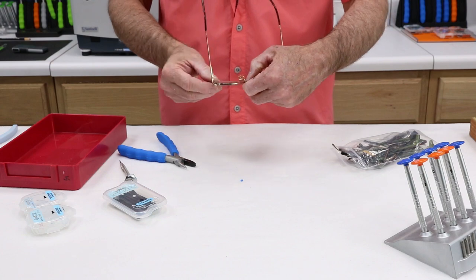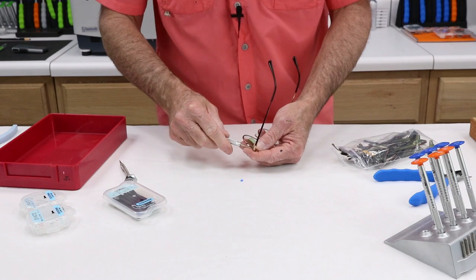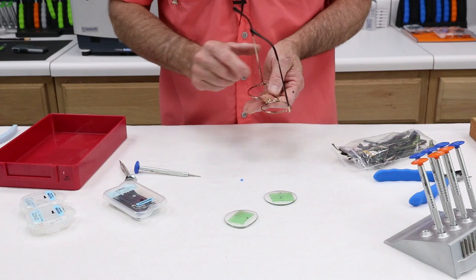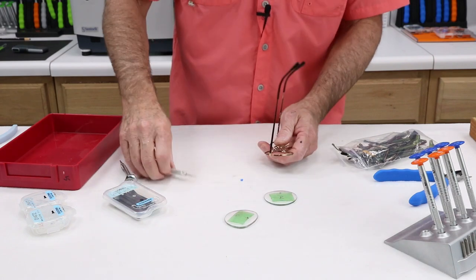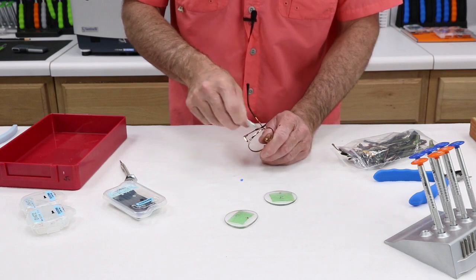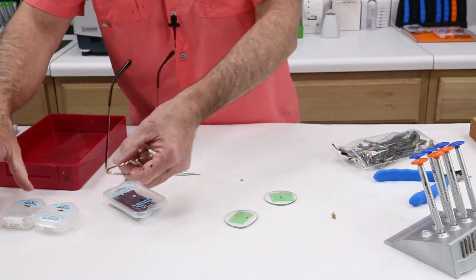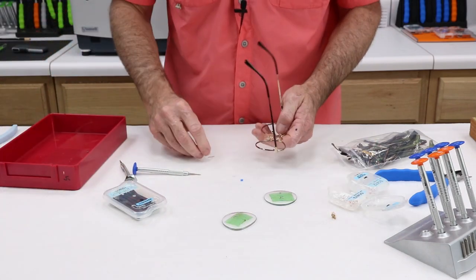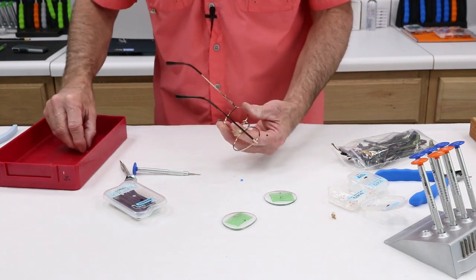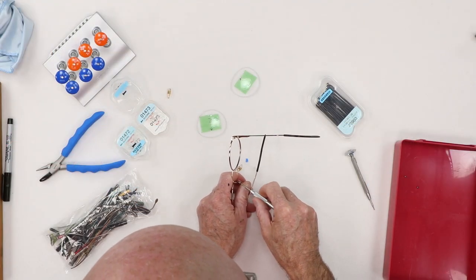Let's address this nose pad situation. Go ahead and get that. This lens is out. The one nose pad is going to come right out — easy as can be. Good, but let's do some metrics. Look at how nicely that brightens that up. One down and then one really hard one to go.